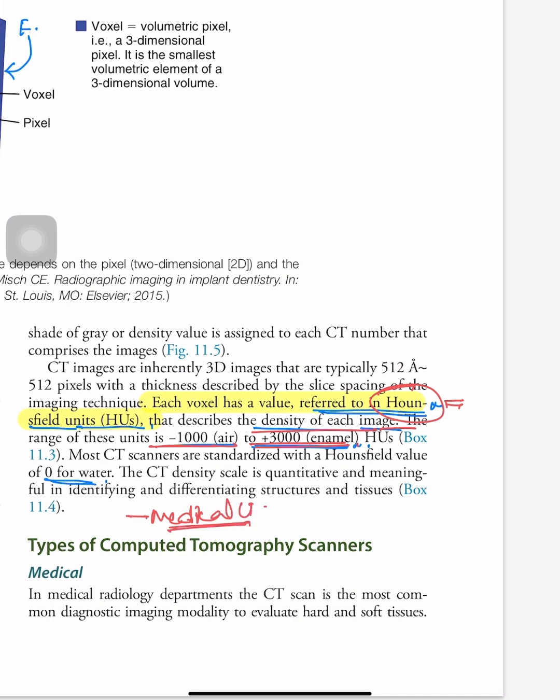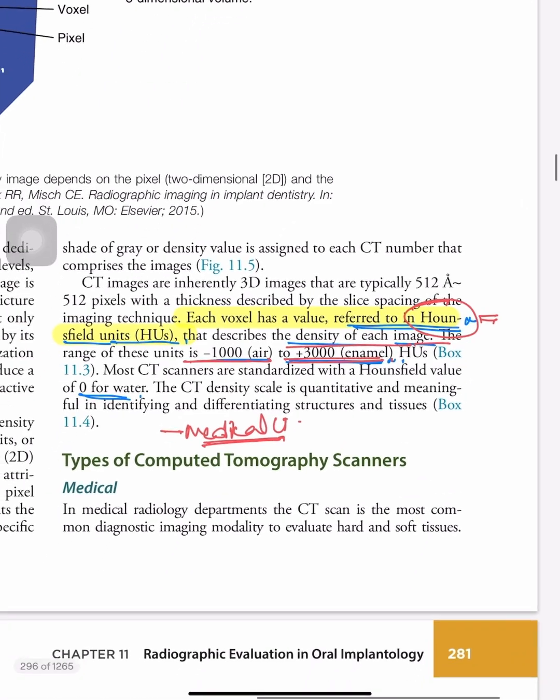But if you have asked for the DICOM file and you are evaluating it yourself, you will get a rough estimation of the Hounsfield unit in the imaging section. I will demonstrate this planning part separately in a separate video, where I'll show you how I plan and check for radio density and all, and where to look for such numbers.